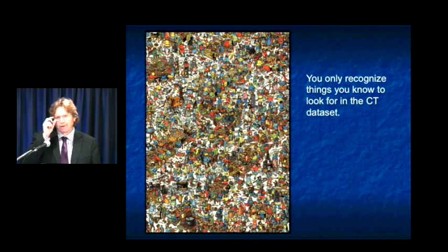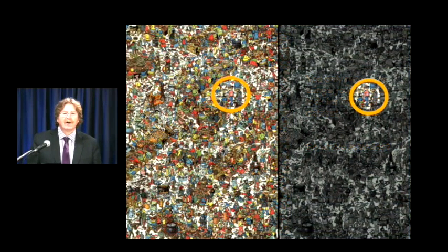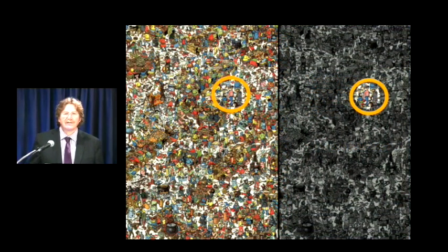So you remember those Waldo cartoons when we were kids. And if I ask you to find Waldo, it's really hard. There's so much noise in this picture. It makes it very difficult to find Waldo. Where is he? And it's always interesting. Once you see Waldo, it becomes very obvious. And so if I put a circle over Waldo, there he is, clear as day.